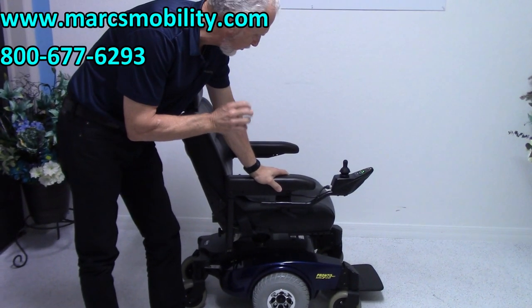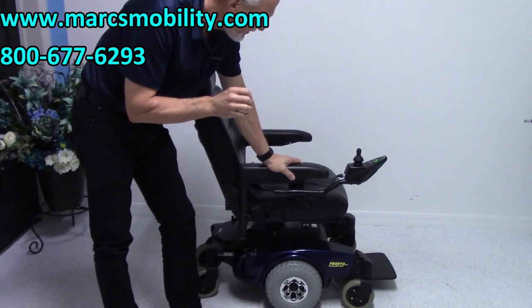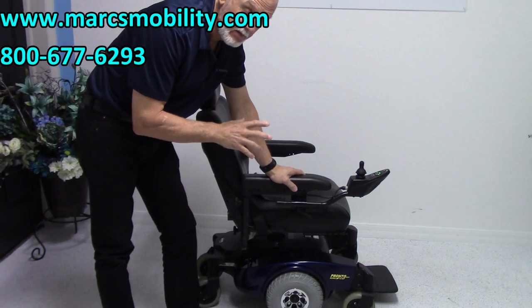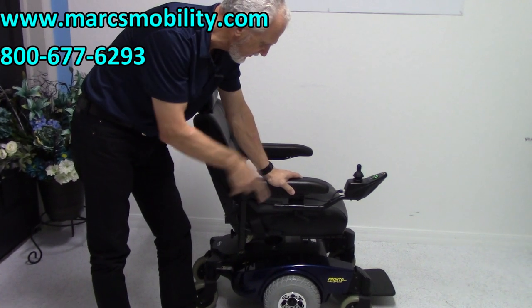This is an Invacare Pronto M51 power chair. This is a great power chair. It's very dependable, great suspension, six wheels on the ground.